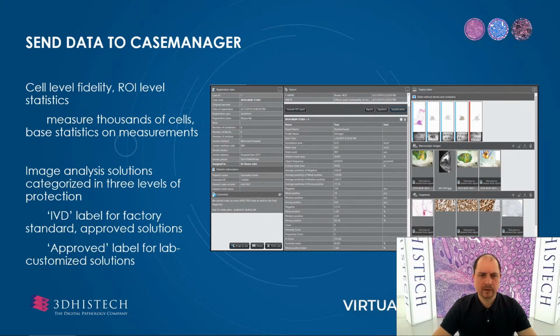On the middle area, there is a quantification tab, and it contains all the measurements sent to a case. It is stored in this form, so a name, a value, and the unit column is displayed. All the other attachments are listed under this table. And by selecting the top right checkbox here, the results will be integrated into the diagnostic report for the current case.